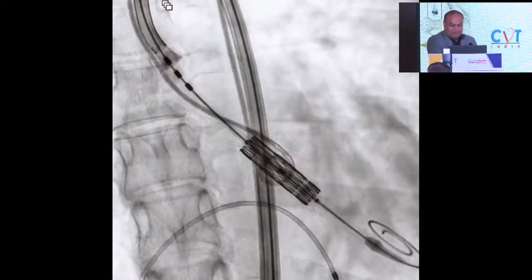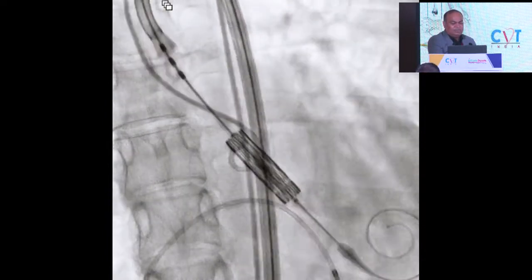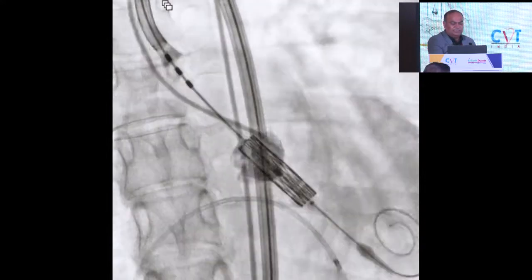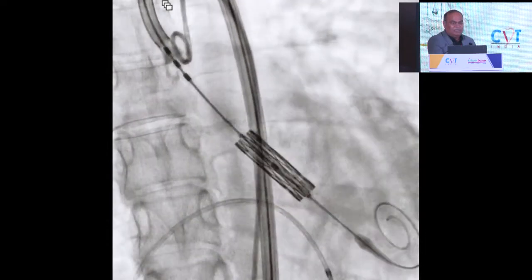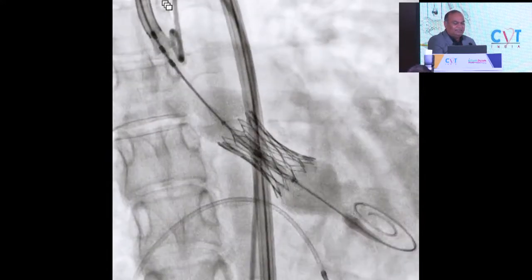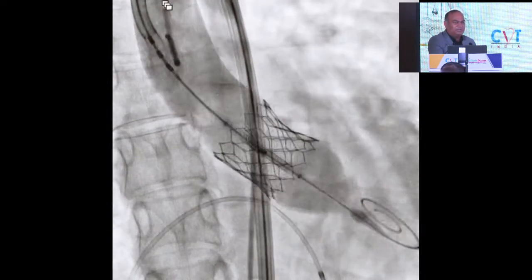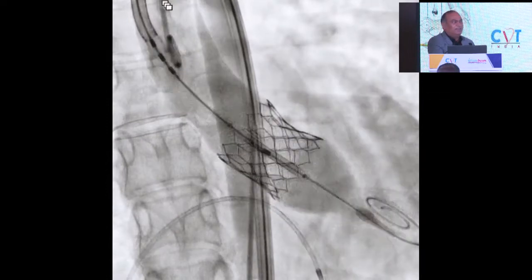This is an example where we're just getting ready with this Sapien. And here is the deployment. Let's see. Okay, pacing on. We typically don't pull the pigtail, at least in our practice. In this case, because of shallow STJ, we pulled. And even at half inflation, when you do an aortogram, you can appreciate how big the balloon looks, right? So the key here is not to inflate the valve fully.